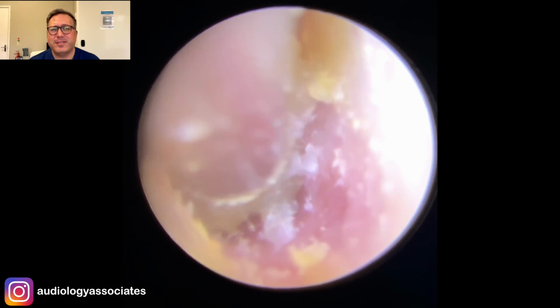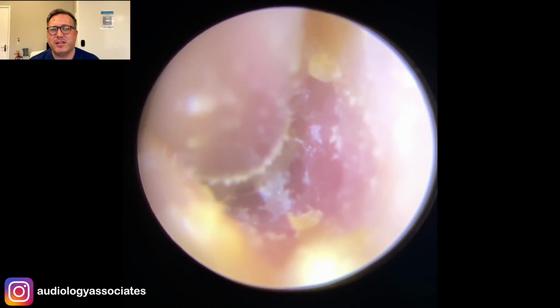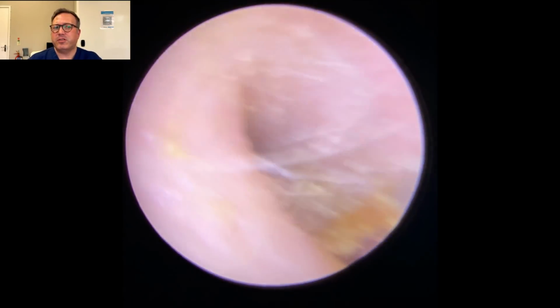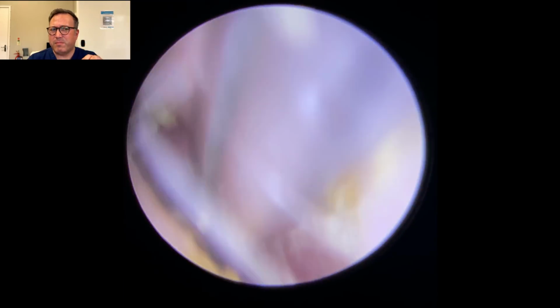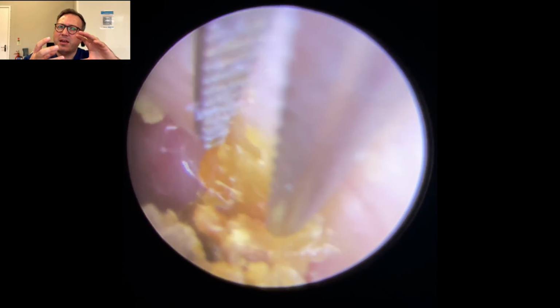There we go. It's starting to work out. It's got a little bit stuck at this point. You can see we've gone as high as we can now to try and peel this along. If it's solid enough, then sometimes we can use the crocodile forceps to get a good grip. You can see I've already tried to pinch this once already, but I'm just going back in now for another pinch.